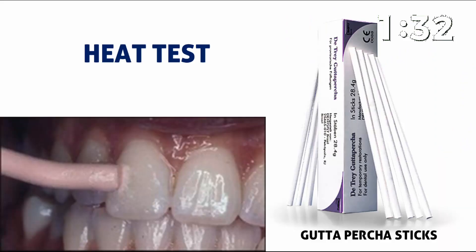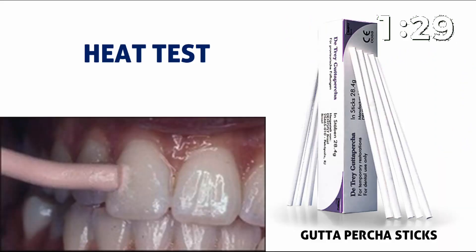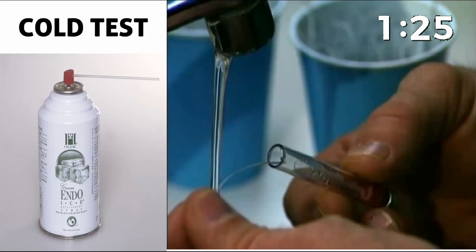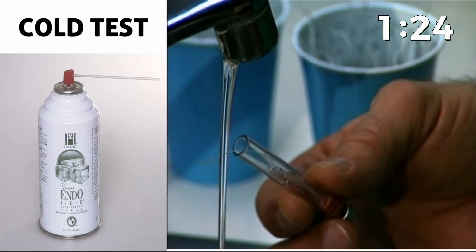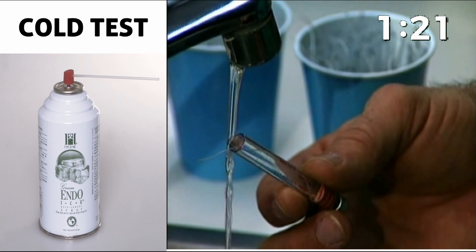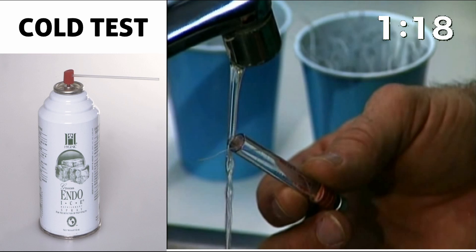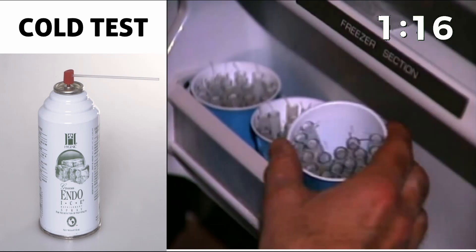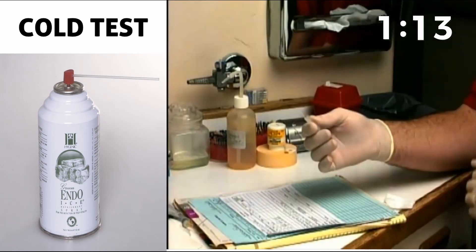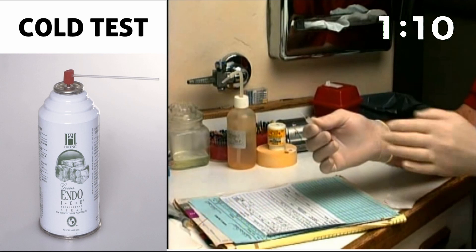For the heat test, we can use a gutta-percha stick, which is different from what is used for endodontic obturation. For the cold test, a small vial filled with water, put in a freezer and made into an ice stick, can be placed on the tooth, or we can use a ready-made endo-ice spray, which is applied to a small cotton pellet kept on the tooth surface to elicit a response.